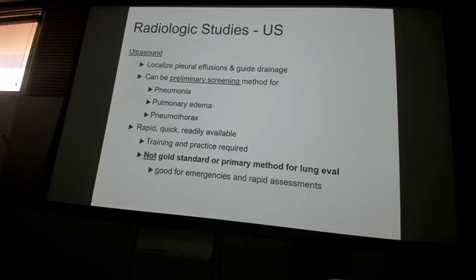If you're deployed, austere environment, you use ultrasound, but I wouldn't hang my hat on it if I have other screening tools necessary, just because it's not going to be the standard of care. If you're going to get a lawsuit, they may come back at you with that. But pulmonary edema, you're going to see the lines come through. Pneumothorax is very good for that, especially ER, aid station type of environment.